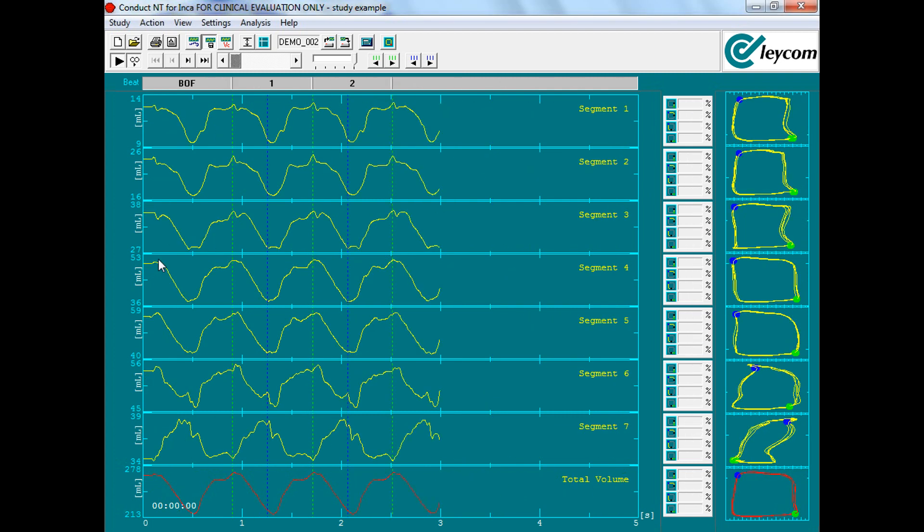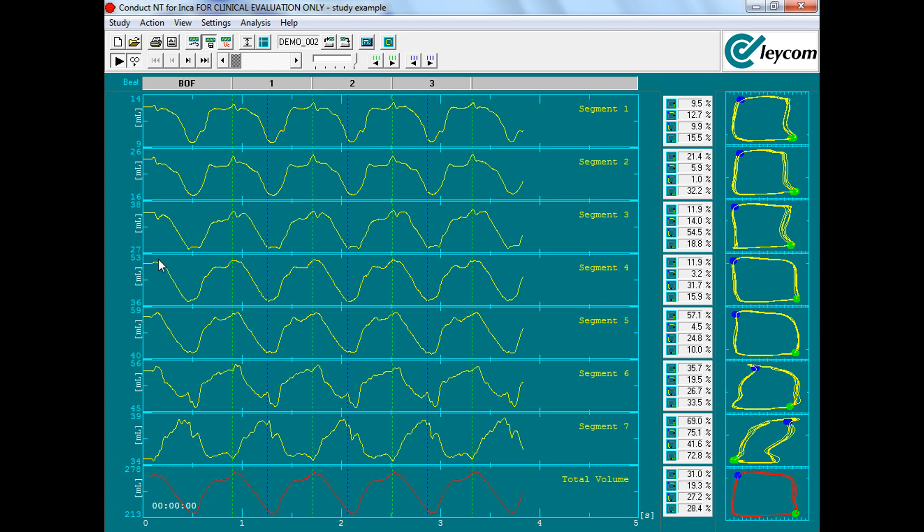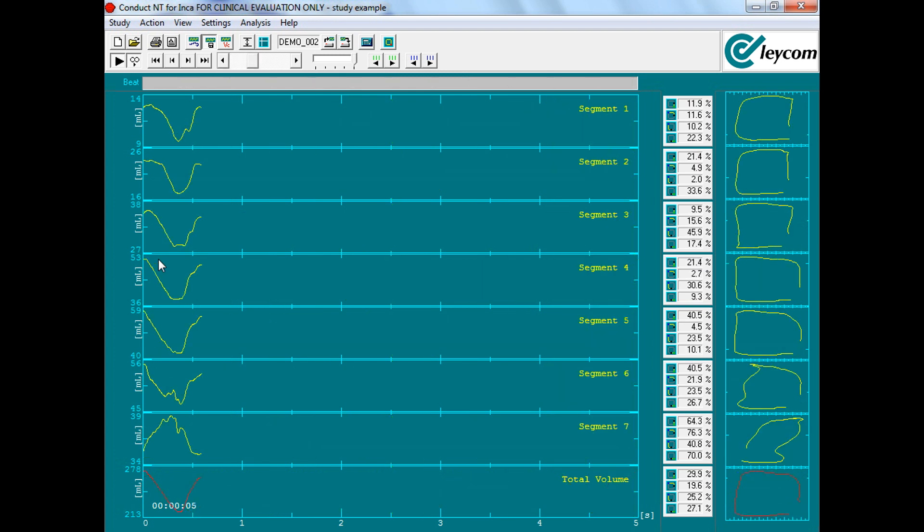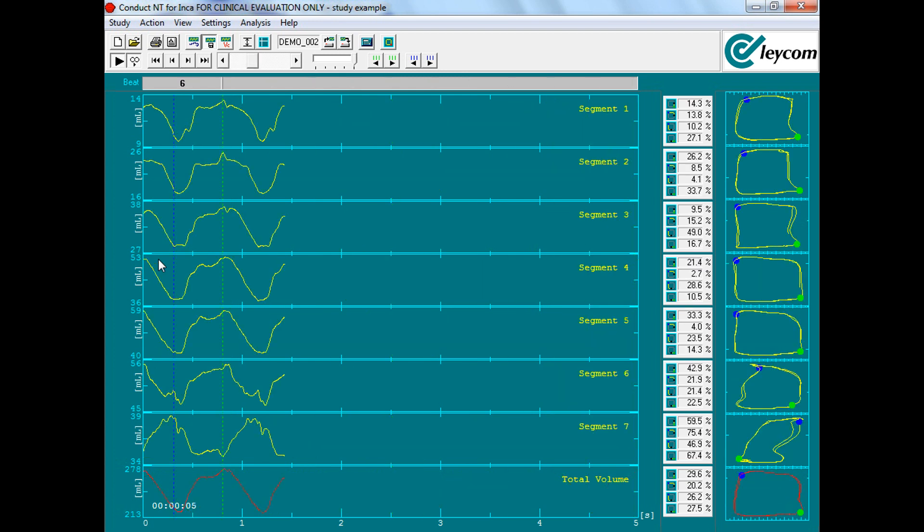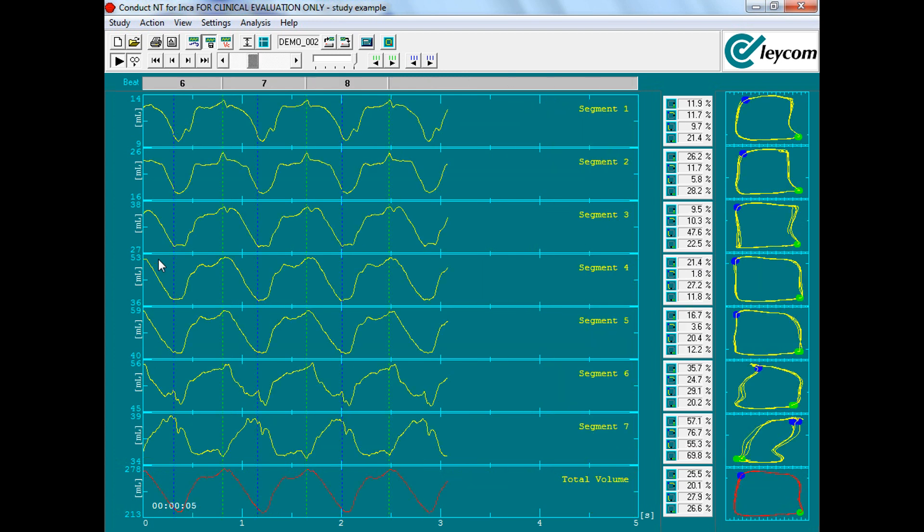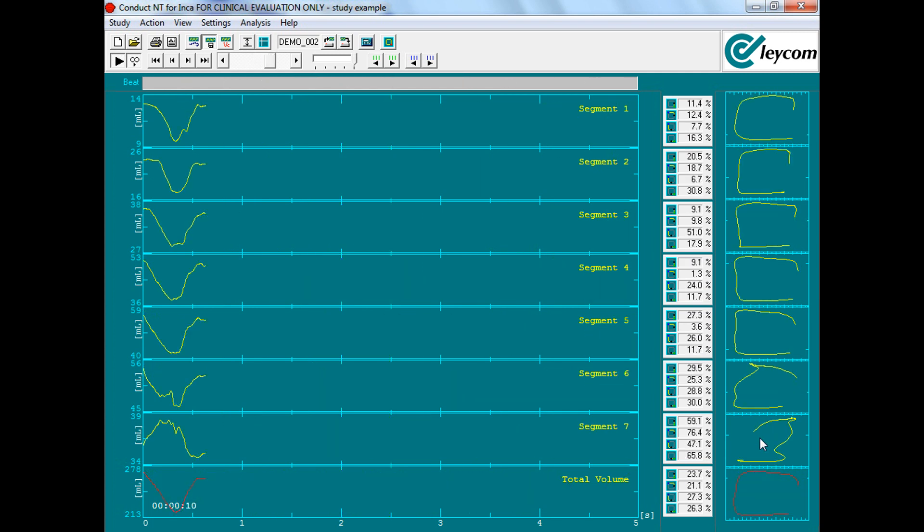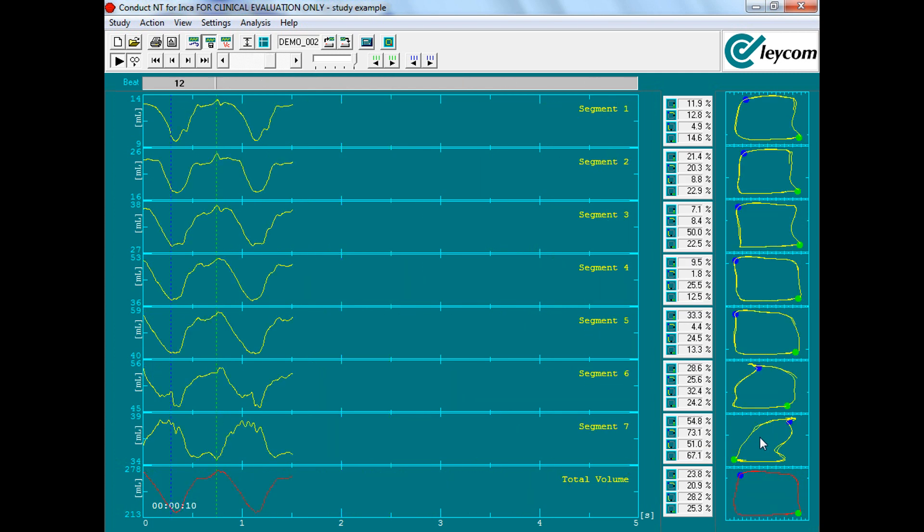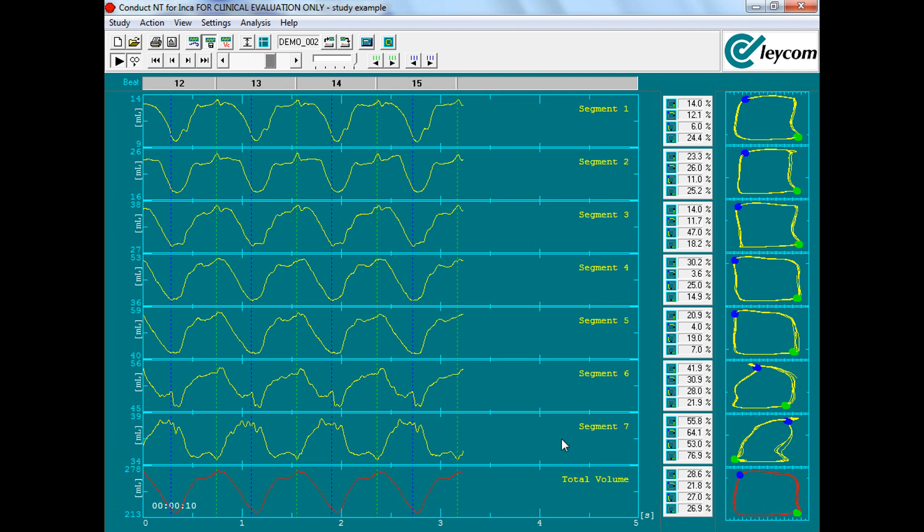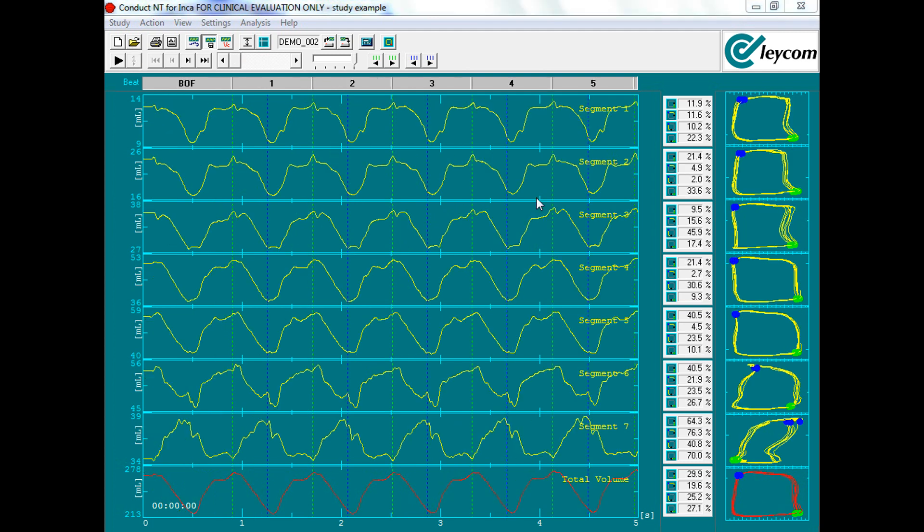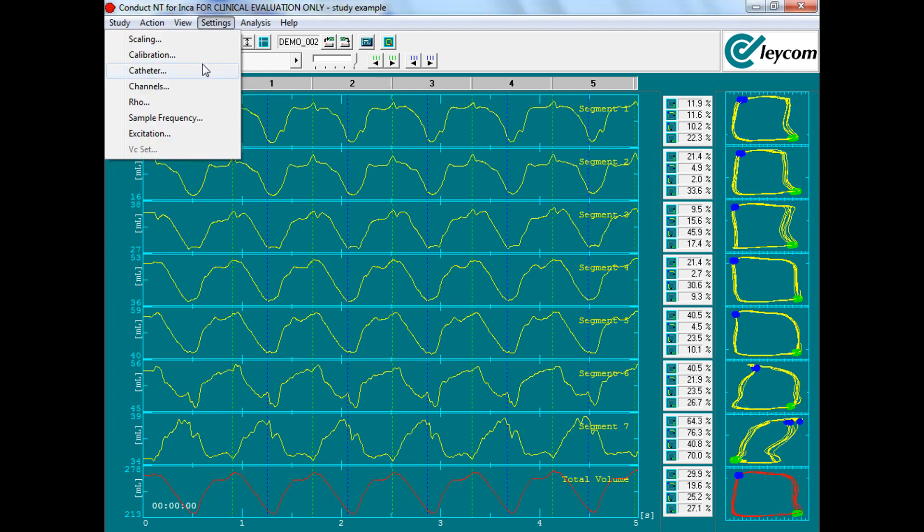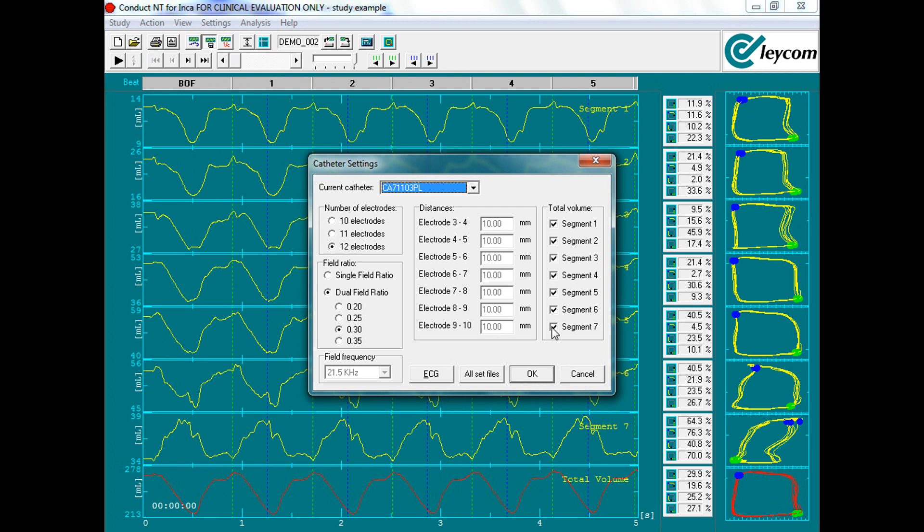After optimal PV loop catheter positioning has been achieved, we'll remove any segments not in the ventricle. This is indicated by a clockwise loop or sometimes a figure of 8, which can be removed very quickly in real time. To do so, you'll go to Settings, Catheter, and remove any segments that you do not wish to have included in the total volume measurement.